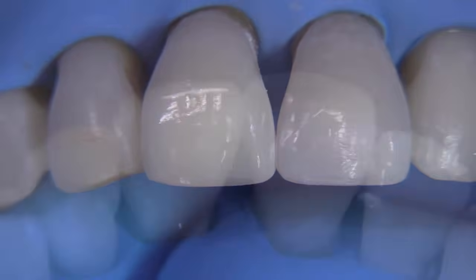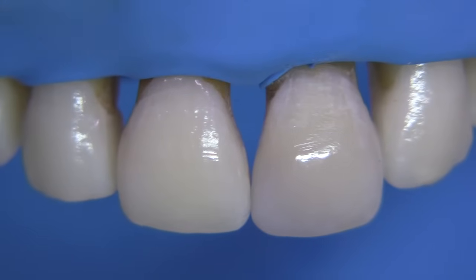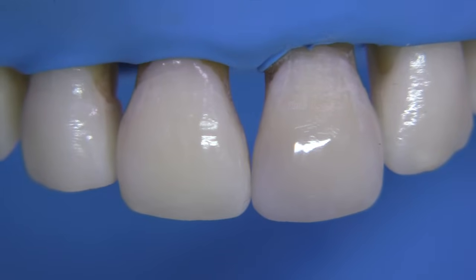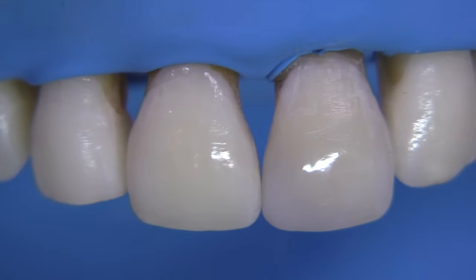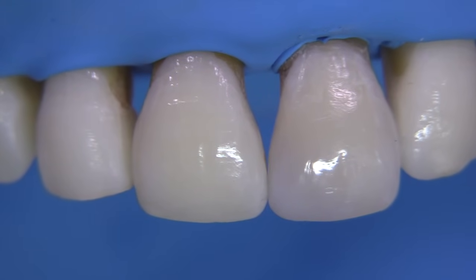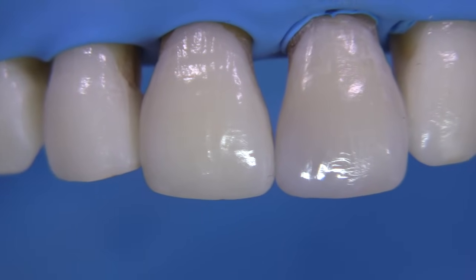Your eyes are more drawn to the texture than to the fact that we don't have a perfectly optimal shade. Getting this to match perfectly is really difficult, but I think we did okay — we have pretty good lingual contours and a decent final result from the facial. We can always do better. Thanks for spending a few minutes with me watching this video — I hope it helps. Give me comments and feedback. Take care, thanks.